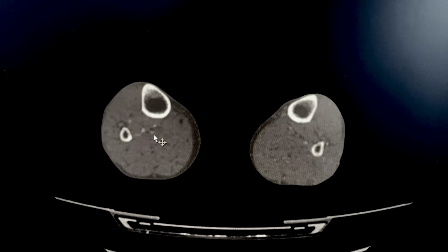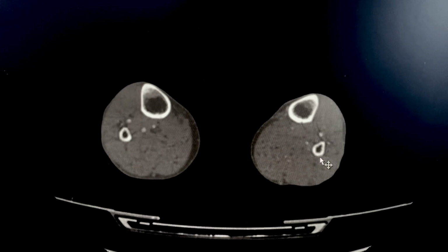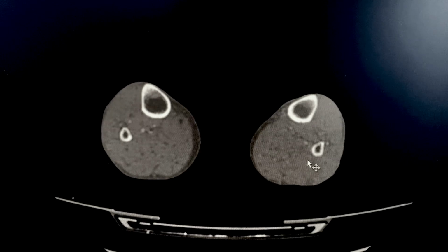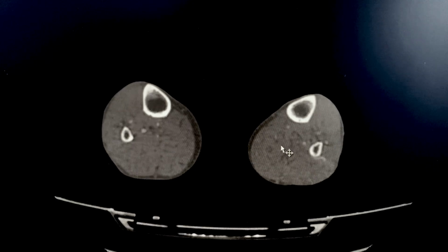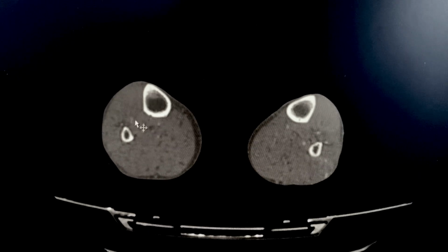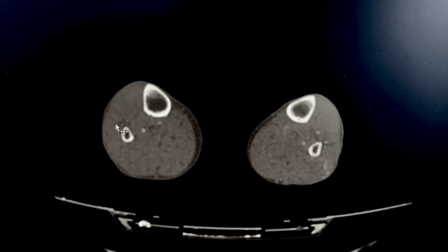And as you go down, you can see here that on the left, eventually the anterior tibial artery is occluded, leaving the peroneal as well as the posterior tibial arteries open just about, and you can also see on the right that the anterior tibial artery here also gets occluded.